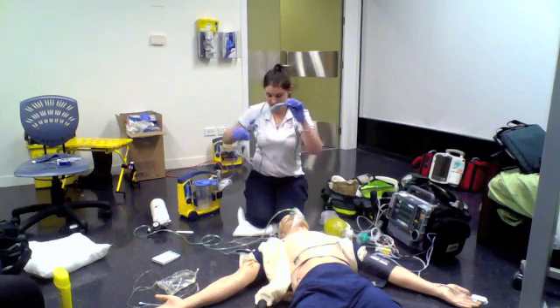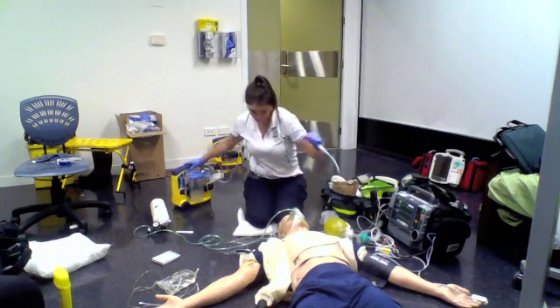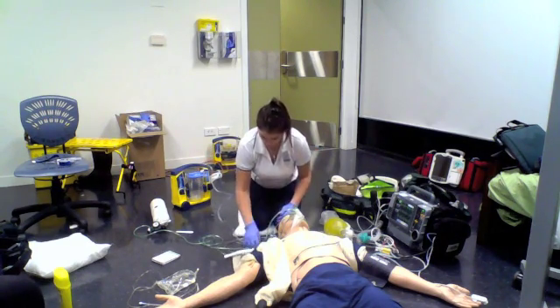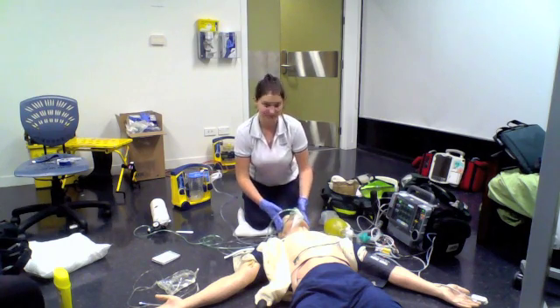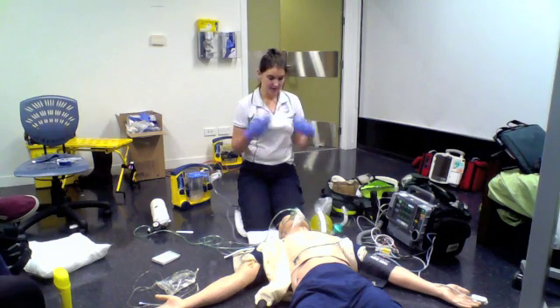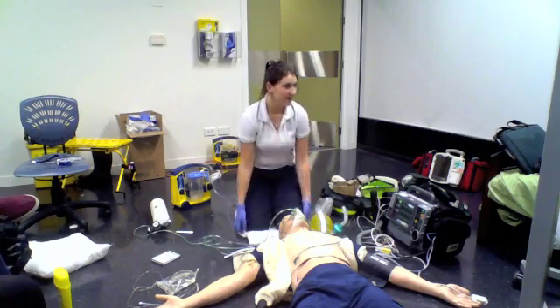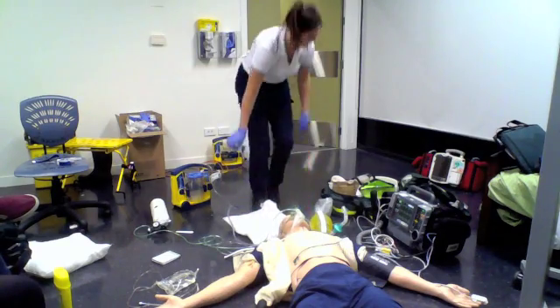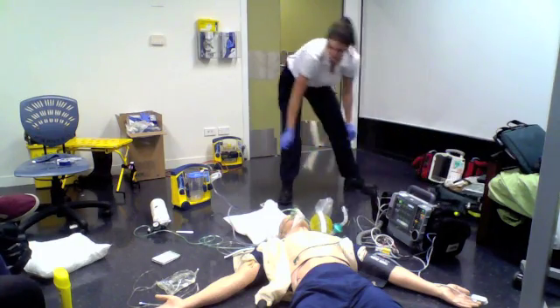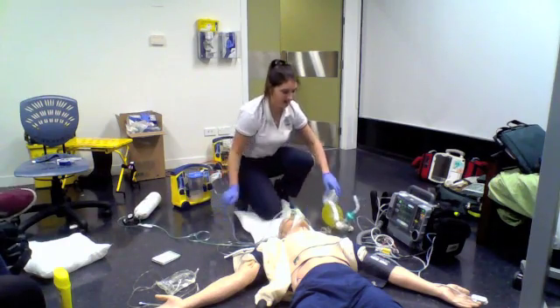Another thing we're going to need is the suction unit readily available to us. We're just going to place a suction catheter under the shoulder of the patient, so that if the ICP needs it, it's there ready to go. I am going to then do a full set of vitals and keep monitoring the patient. The next thing I'm going to do is declutter the area, remove anything that we don't need, and keep everything nice and tidy and ready to go.